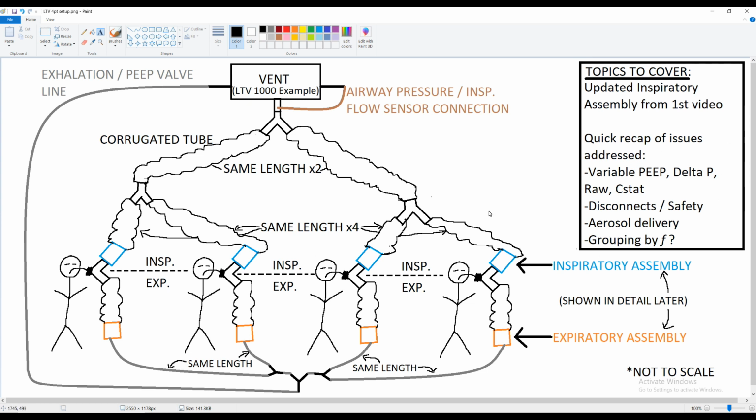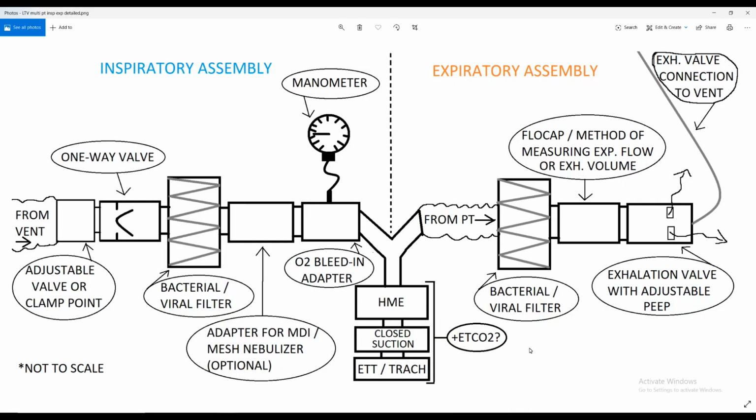I'm going to leave this alone for just a second. Let's take a look at the inspiratory expiratory assembly in detail. So this also has remained largely the same. All I did was add two things. So if we look over here, there's an extra little piece in front of this little one-way valve, and then I also added on maybe end-tidal CO2.